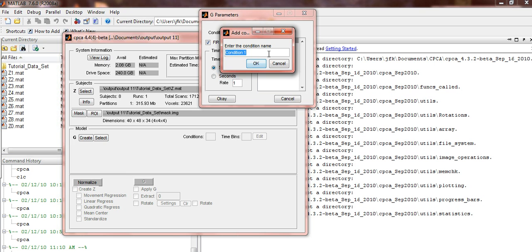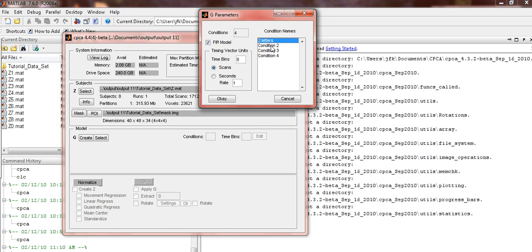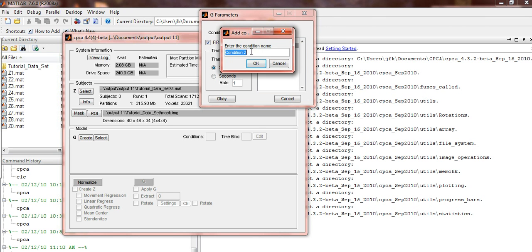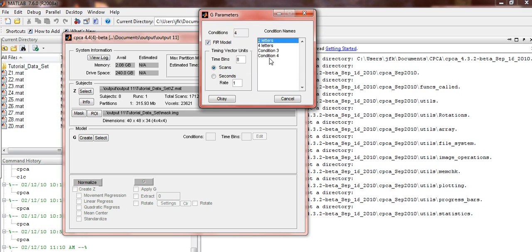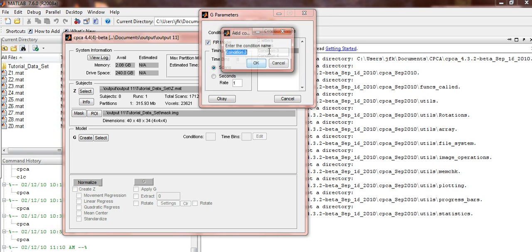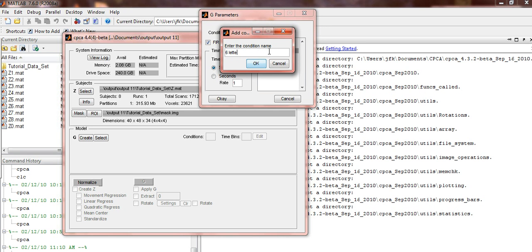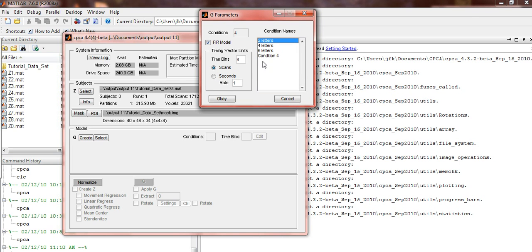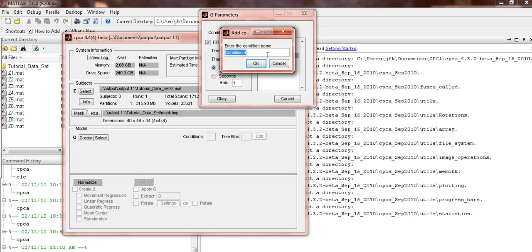Condition 1 will be 2 letters. Condition 2, 4 letters. Condition 3, 6 letters. Condition 4, 8 letters. Press OK.